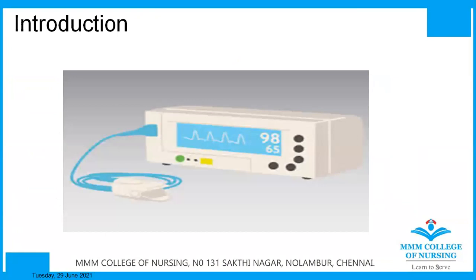Introduction. This graphical waveform and the readings show us the pulse oximetry level and the plethysmography waveform.